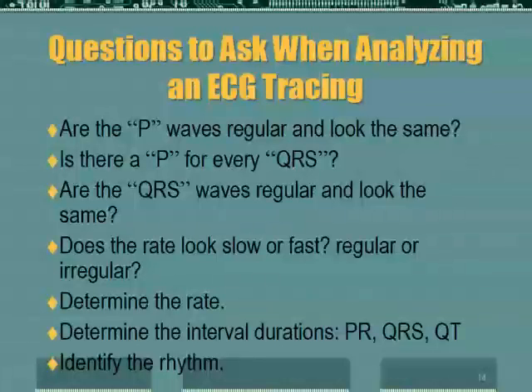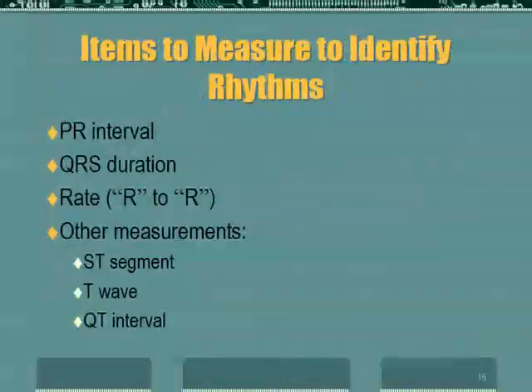This lecture just gives you a quick overview on some of the most common tracings that you may see. Once you get into practice, if you decide to work in a cardiac intensive care unit, you will get probably a couple of weeks, if not longer, of classes that will deal with how to actually interpret EKG tracings and those types of things. You'll get a much more in-depth class that will talk about more analyzing abilities of the tracings.